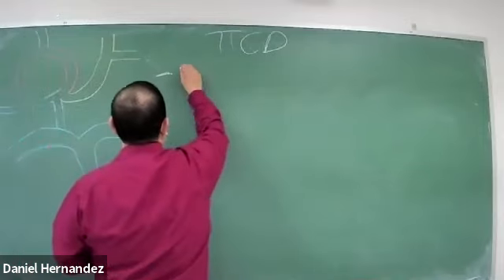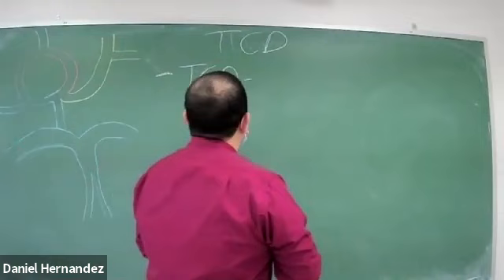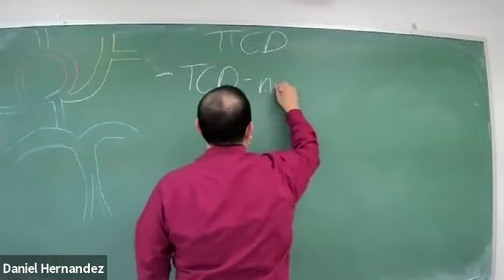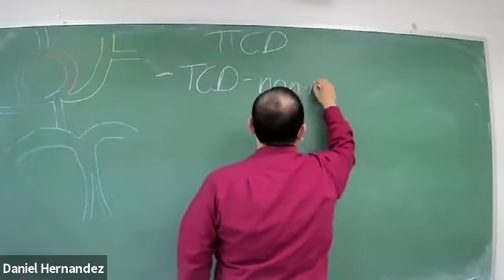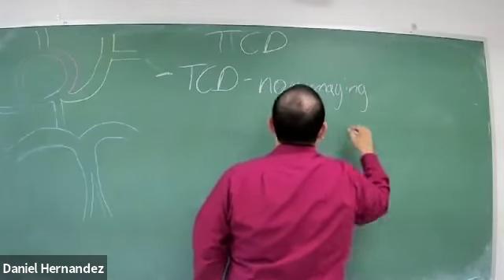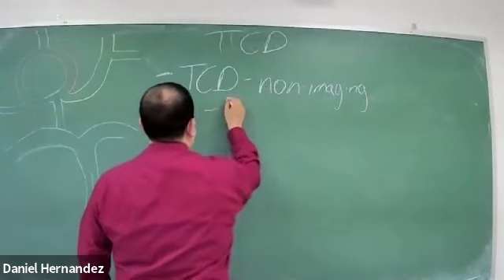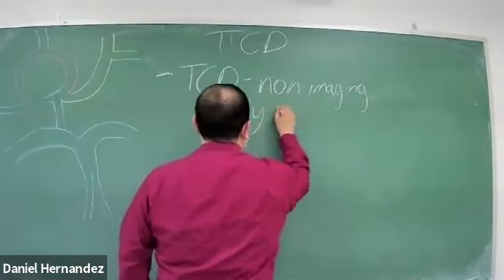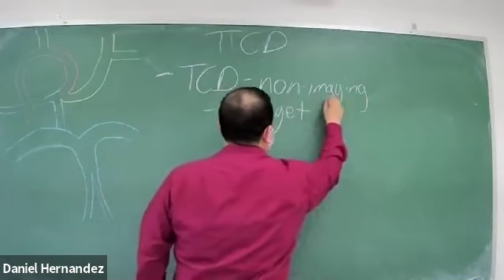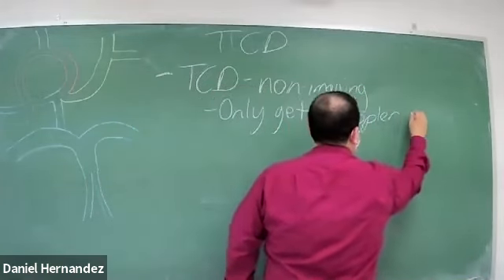We have our original TCD, our transcranial Doppler. This is non-imaging, so we only get Doppler waveforms.